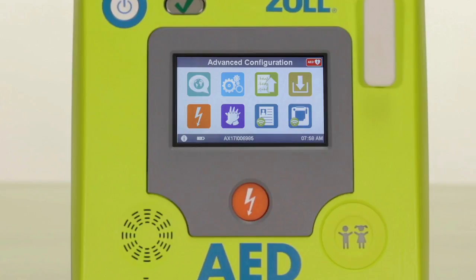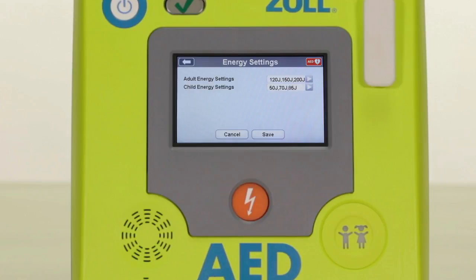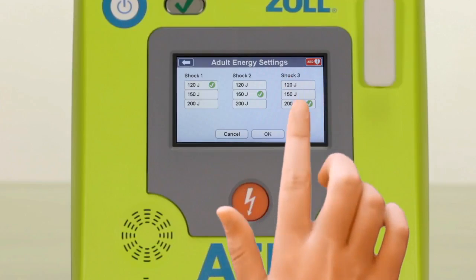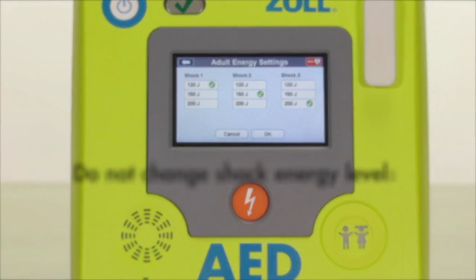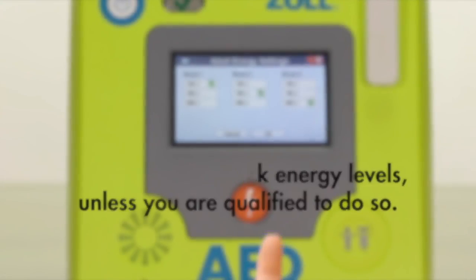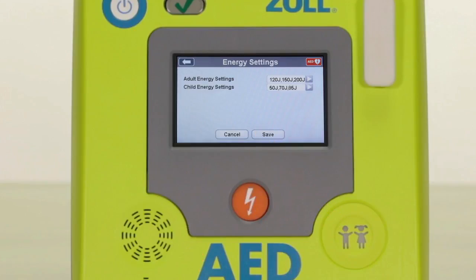To change the energy setting, select the orange shock icon, then select either adult or child energy settings and select the energy settings you would like to use from the table. Select OK, then select save from the previous screen to save your settings.